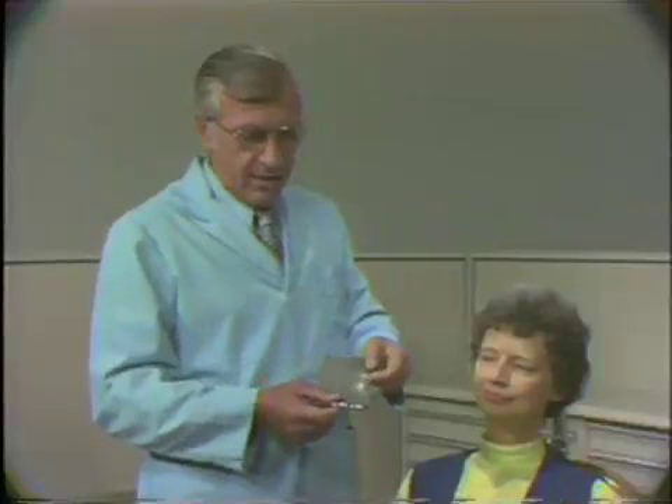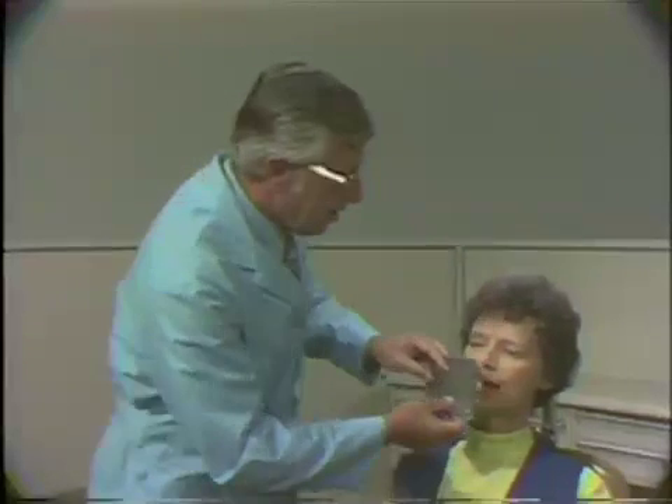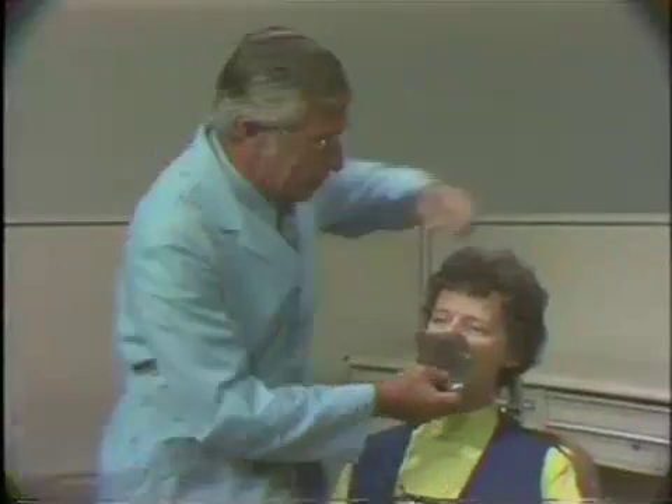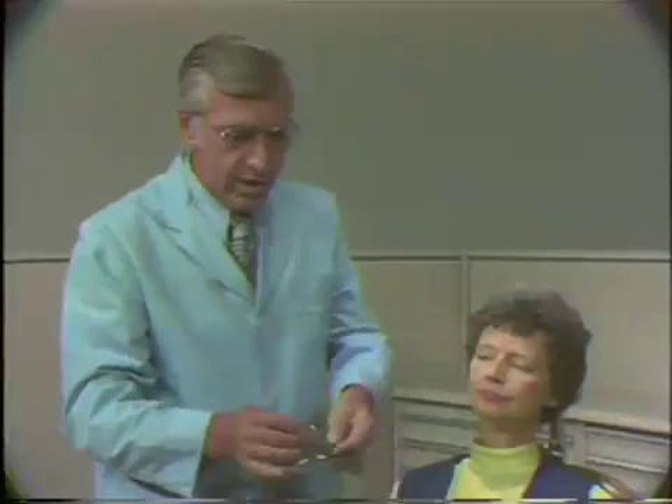The placement of the rubber dam for the isolation of a mandibular anterior tooth is similar to that of the maxillary tooth. The hole in the rubber dam is punched in the midline inferior to the horizontal midline of the rubber dam. It may be placed in either one of two methods. The hole in the rubber dam may be placed over the tooth in question, isolating the tooth, and the rubber dam clamp forceps can be carried to the tooth in this fashion. An alternative method is to place the wings of the clamp in the hole of the rubber dam and then carry the rubber dam and the clamp to the tooth.